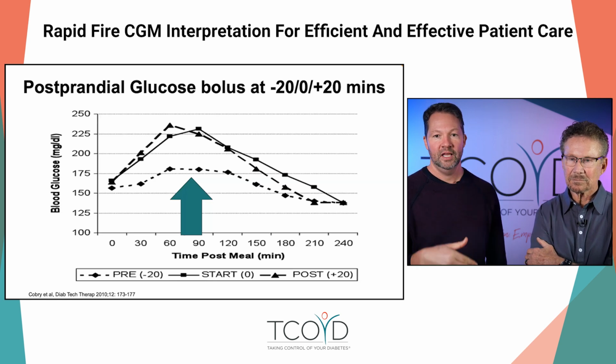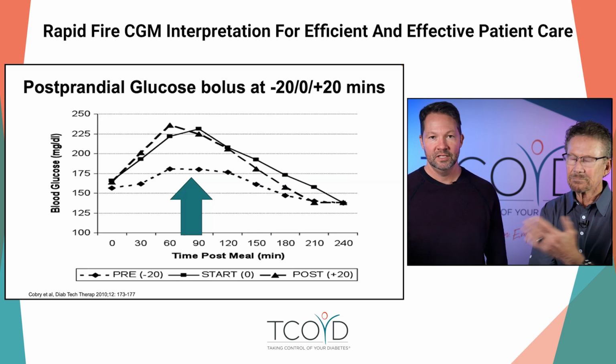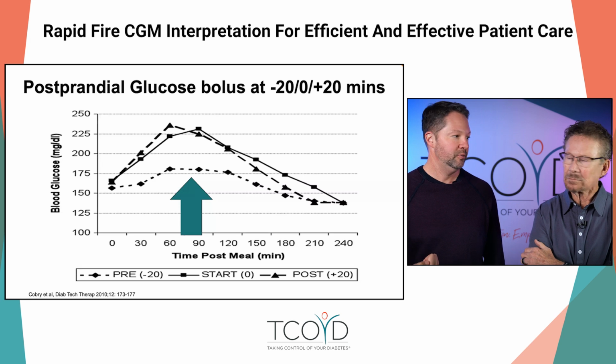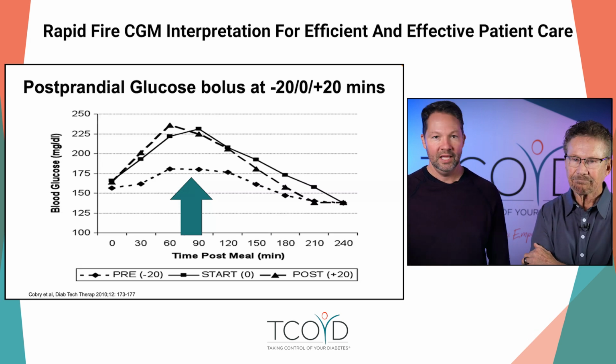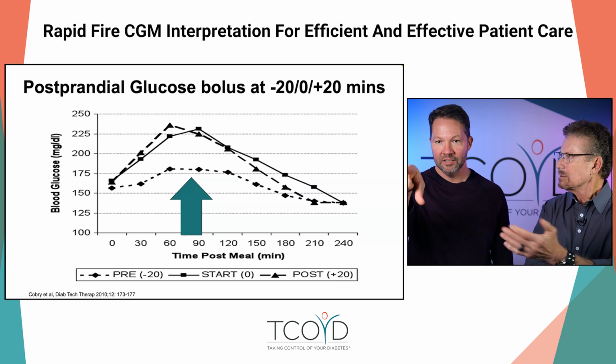And I also like to say that if you do it at the time that you eat versus 20 minutes after, it doesn't matter. So what I take from that is if you bolus right when you eat, you're already way too late. You're behind the eight ball. You're never going to get it quite right. And then ultimately everybody comes down to the right place.